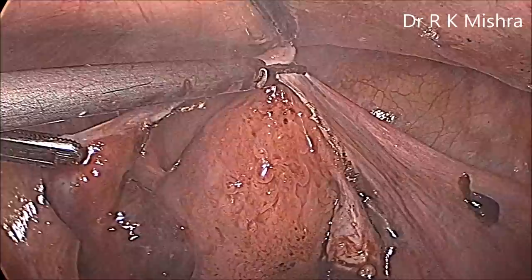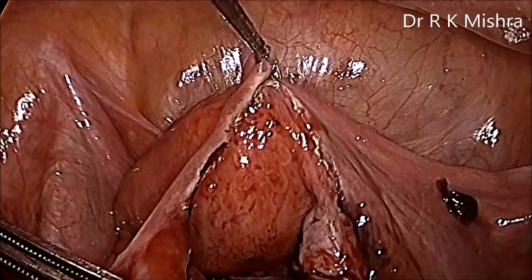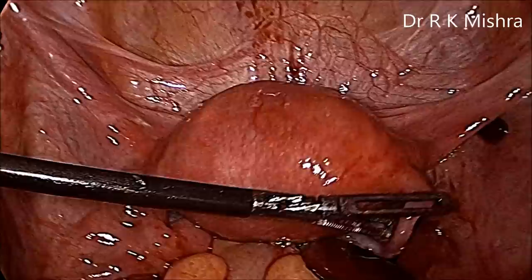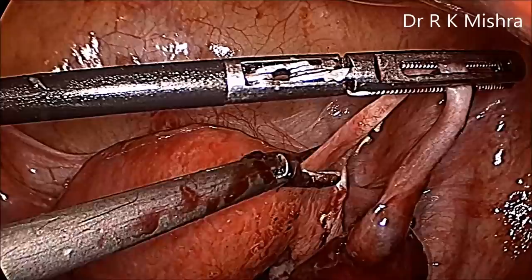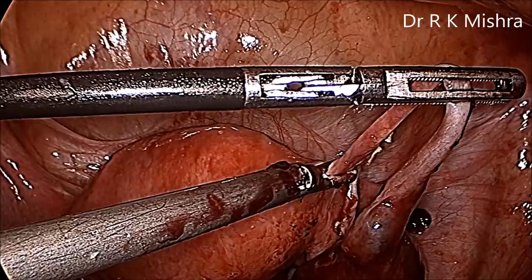Slowly, keeping the harmonic as near as possible to the tube, you can separate it from the mesosalpinx. The Stryker mini-laparoscope is removed. Approximately 6 mm of the proximal tube attached to the uterus should be coagulated first so that it is sealed nicely. After coagulating a couple of times, we cut the tube so that there will be no uteroperitoneal fistula.